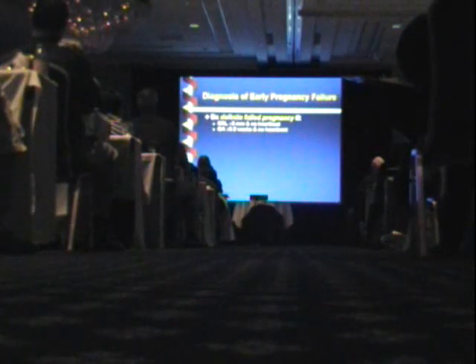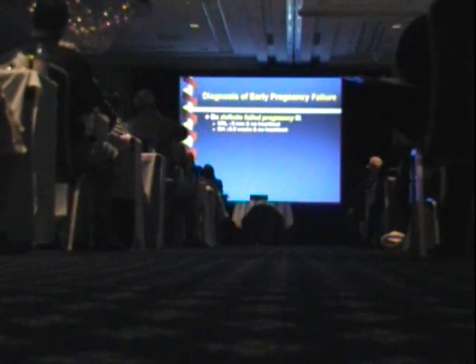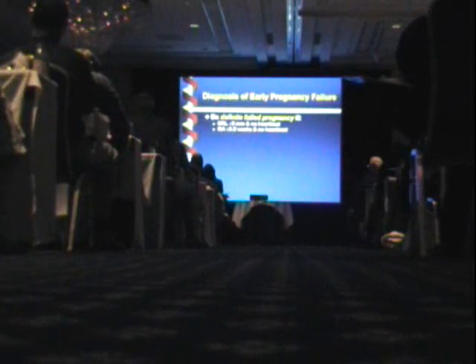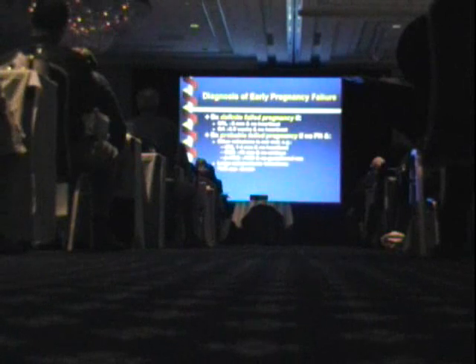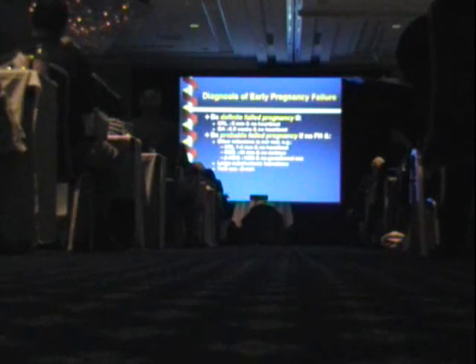If the woman's LMP puts her at 6.5 weeks and I see no heartbeat, I don't say that's a definite failed pregnancy, because the LMP is notoriously unreliable. But if I know it's 6.5 weeks based on an earlier ultrasound or based on an in vitro fertilization embryo transfer, and there's no heartbeat at 6.5 weeks, then it's a definite failed pregnancy. Basically, any other milestone I consider worrisome, but not definitive.